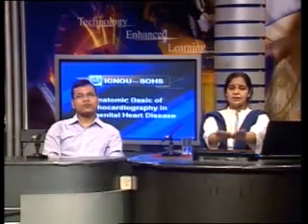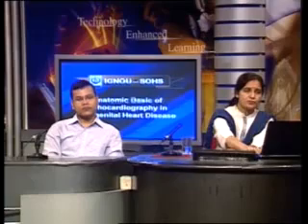Why we are labeling these are the basic things. Without doing all these things, it cannot be complete. You cannot proceed in congenital heart disease. You should know how to go, and then come to why it is this chamber or that chamber. That again is equally important. We have to go by the sequential analysis as I described, starting from the subcostal, then to the suprasternal view, sequentially.